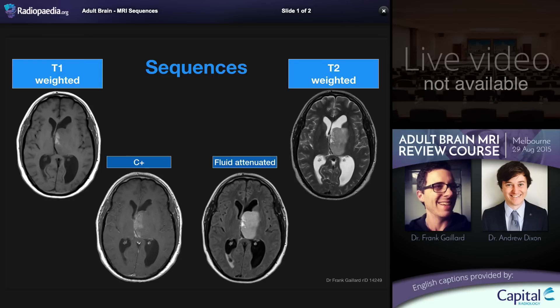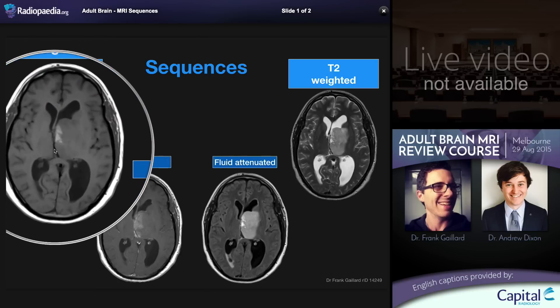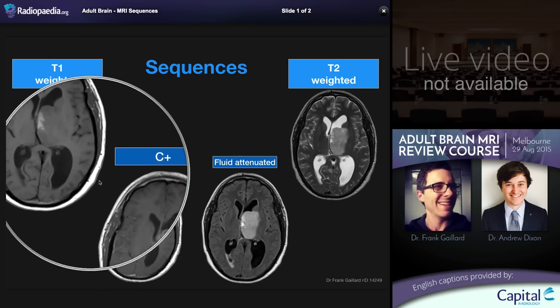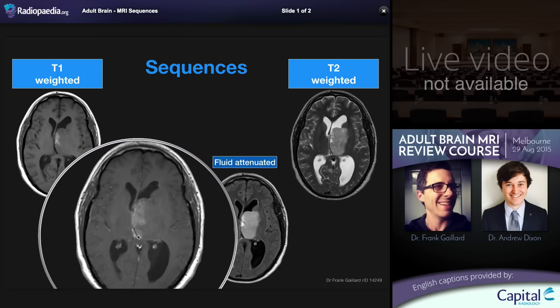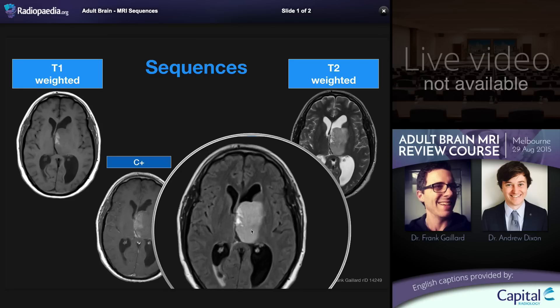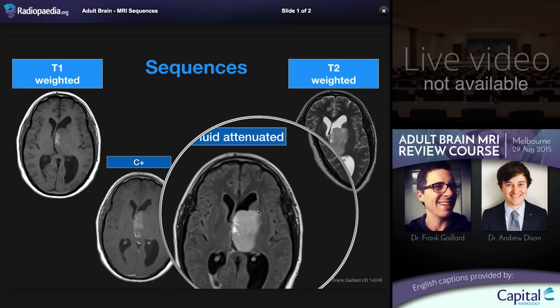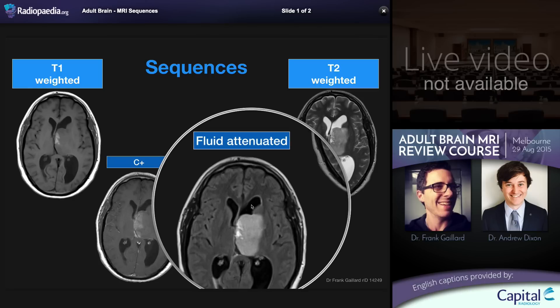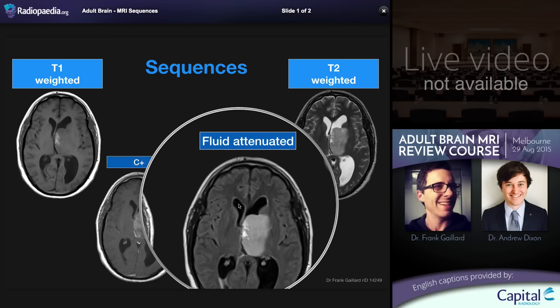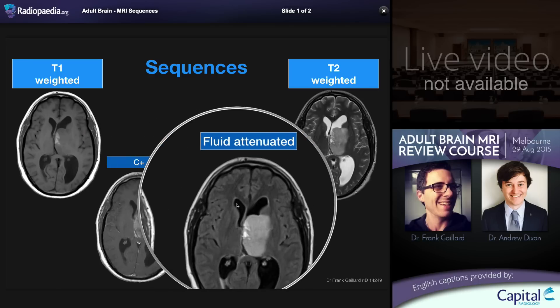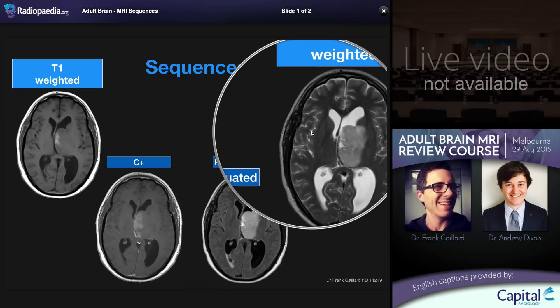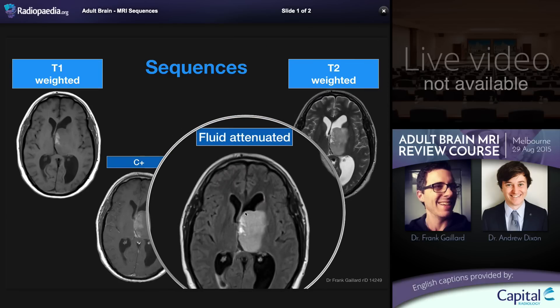Taking T1 and T2 weighted imaging, we can see the first ways we can modify these images. The first is to add gadolinium and then perform T1 weighted sequences. In this case of a thalamic primary brain tumor with some hemorrhagic change showing intrinsic high T1 signal, we can see that another component demonstrates contrast enhancement. The most common modifier for T2 weighted images is fluid attenuation — usually referred to as FLAIR. Here we see the same tumor standing out more brightly against the white matter now that the CSF within the ventricles has been attenuated. Note that despite CSF being dark on FLAIR — similar to T1 — the relationship of white matter to grey matter remains that of a T2 weighted sequence, which is why this relationship is the more reliable way to distinguish T1 from T2.